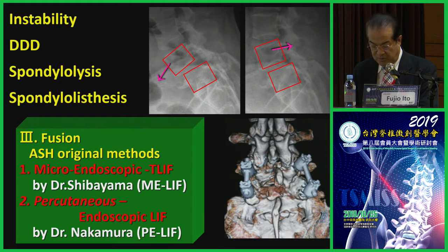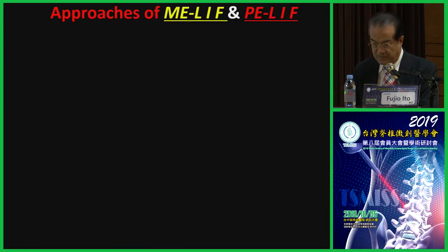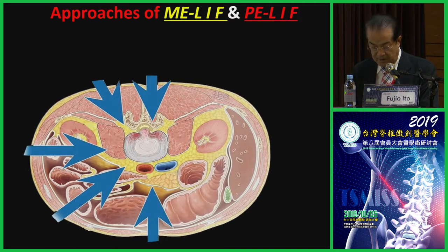Aichi Spine Hospital developed two original fusion methods. One is microendoscopic LIF, and the other is percutaneous full endoscopic interbody fusion. Both original methods are indirect decompression and don't need canal invasion. Our developed MEL-LIF and PE-LIF are indirect decompression methods. This figure shows other fusion approaches.